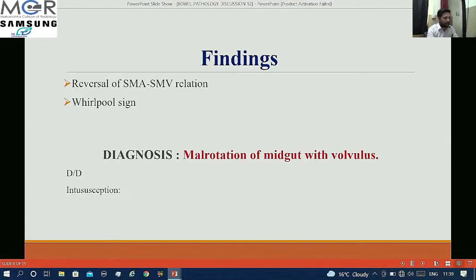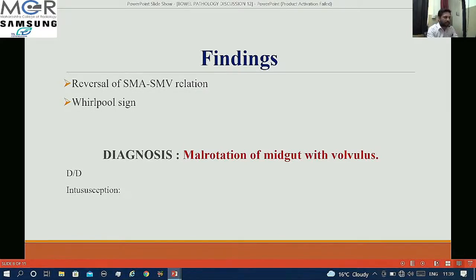With the whirlpool sign and twisting of the bowel with reversal of SMA and SMV relation, my diagnosis in this case was malrotation of midgut with volvulus. The closest differential was intussusception. The distinguishing point: the whirlpool sign is seen in volvulus, whereas in intussusception we get the classical target appearance involving the intussusceptum and intussuscepiens.